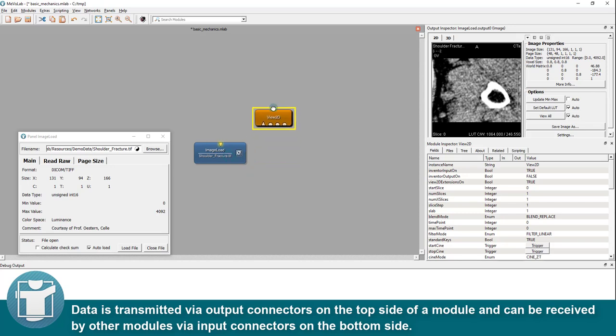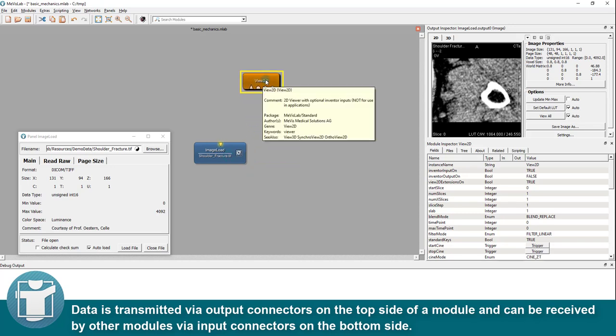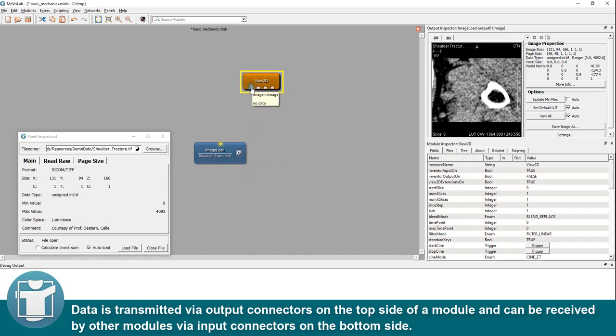Data is transmitted via output connectors on the top side of a module and can be received by other modules via input connectors on the bottom side.